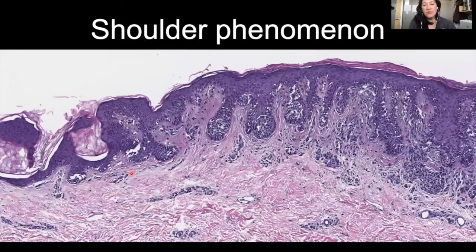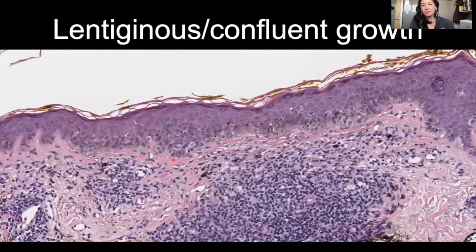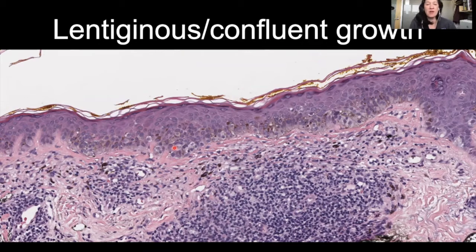Shoulder phenomenon is where you have a compound melanocytic proliferation and your junctional component extends far beyond the dermal component. In this example, here's our dermal component off to the right, and our junctional component just keeps going — that's the shoulder. Lentiginous or confluent growth is where you have crowded melanocytes marching along the line without any space between them — no keratinocytes between these. It can be single cells or nests.